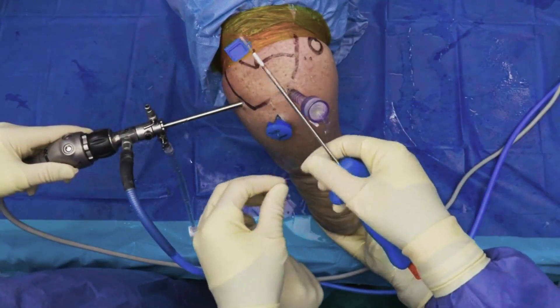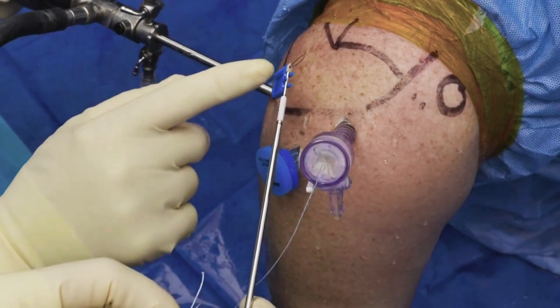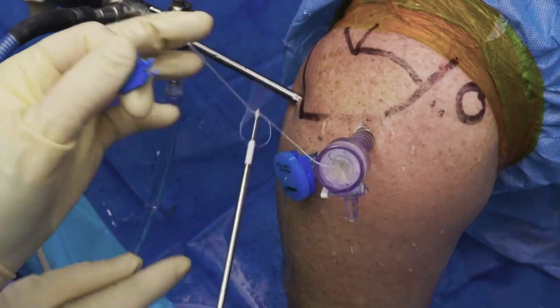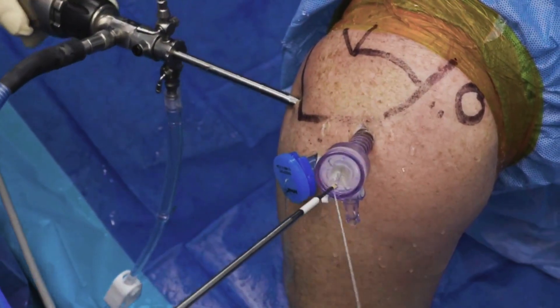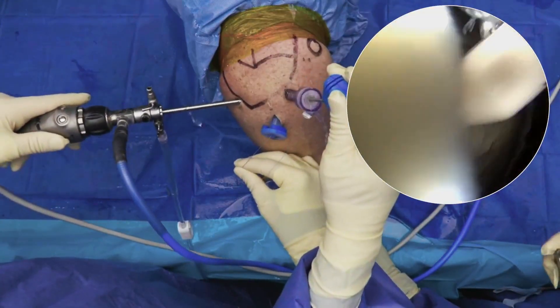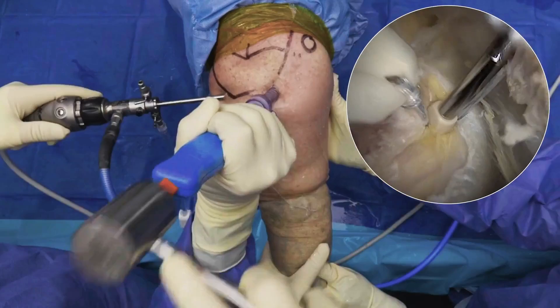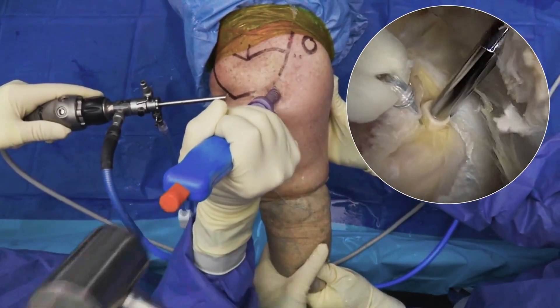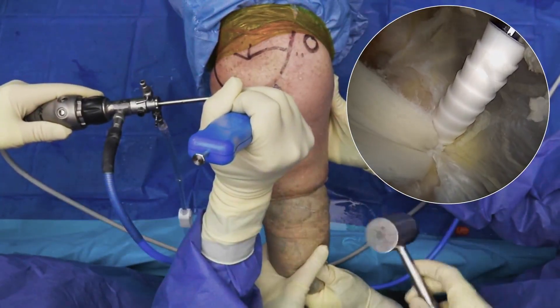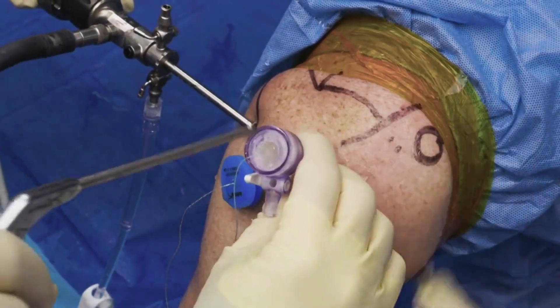A 3.5-millimeter self-punching push lock will be placed adjacent to the anterior lateral swivel lock anchor that was utilized during the transosseous equivalent repair. The 3.5-millimeter push lock anchor has a self-punching peak tip. This affords the ability to minimize the amount of soft tissue dissection, anterior or posterior laterally. The anchor is introduced while keeping tension on the suture and positioning it adjacent to the previous swivel lock anchor along the anterolateral edge of the footprint. The anchor is gently impacted into position. The inserter is unscrewed, detaching itself from the implant. A side cutter is used to cut the suture.